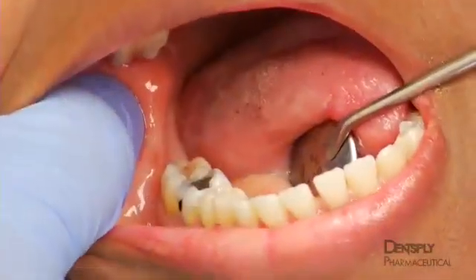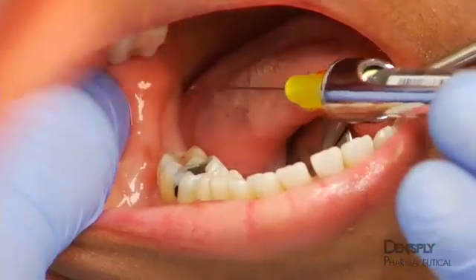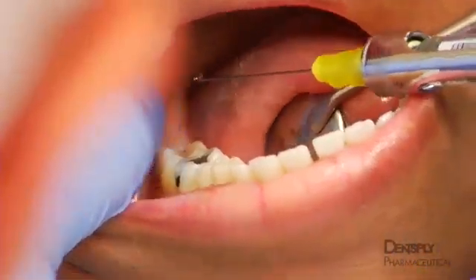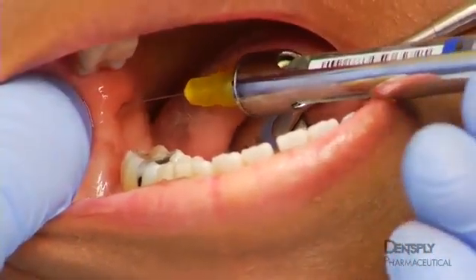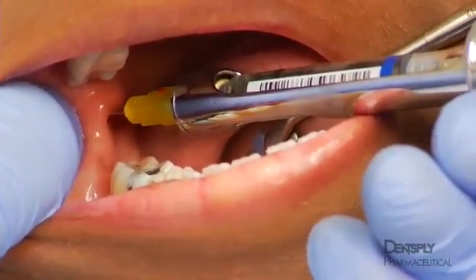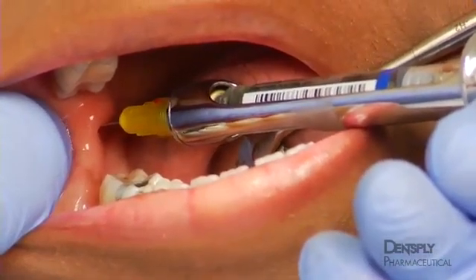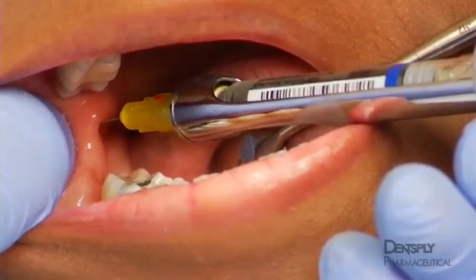With the syringe oriented over the opposite premolars, the needle is advanced to the insertion point lateral to the pterygomandibular raphe and at the height of an imaginary line bisecting the thumbnail. The needle is then inserted slowly through the mucosa and buccinator muscle and into the pterygomandibular space. A few drops of anesthetic solution delivered as the needle is advanced may help reduce the discomfort of needle insertion.